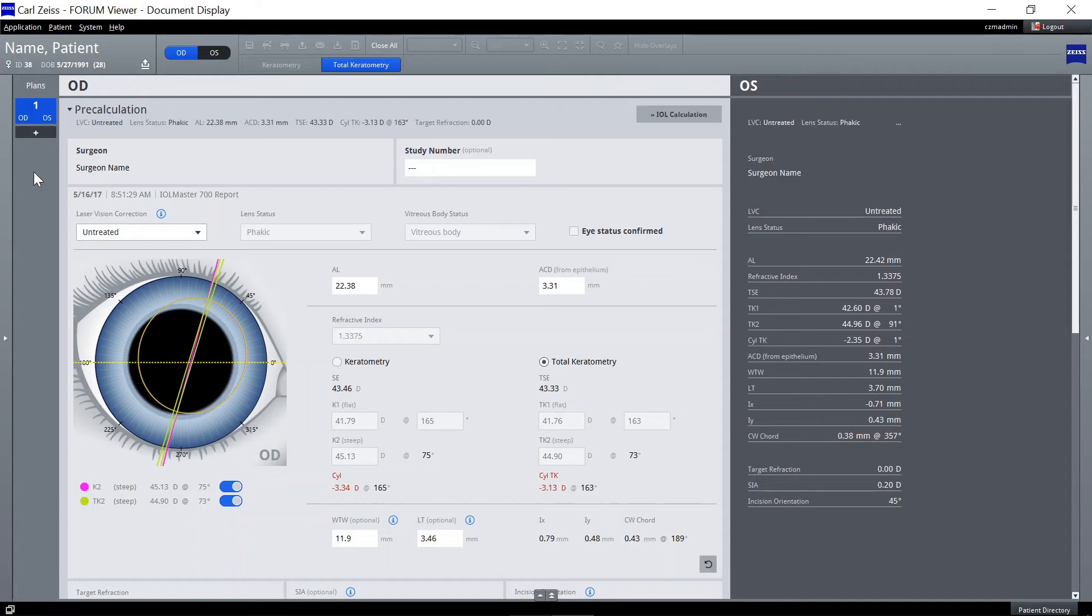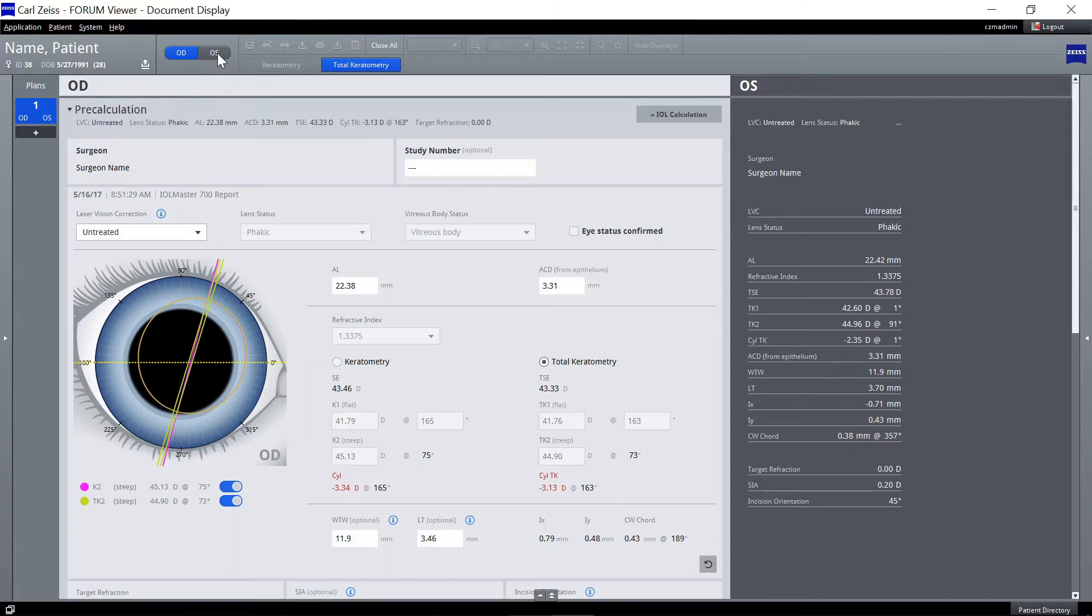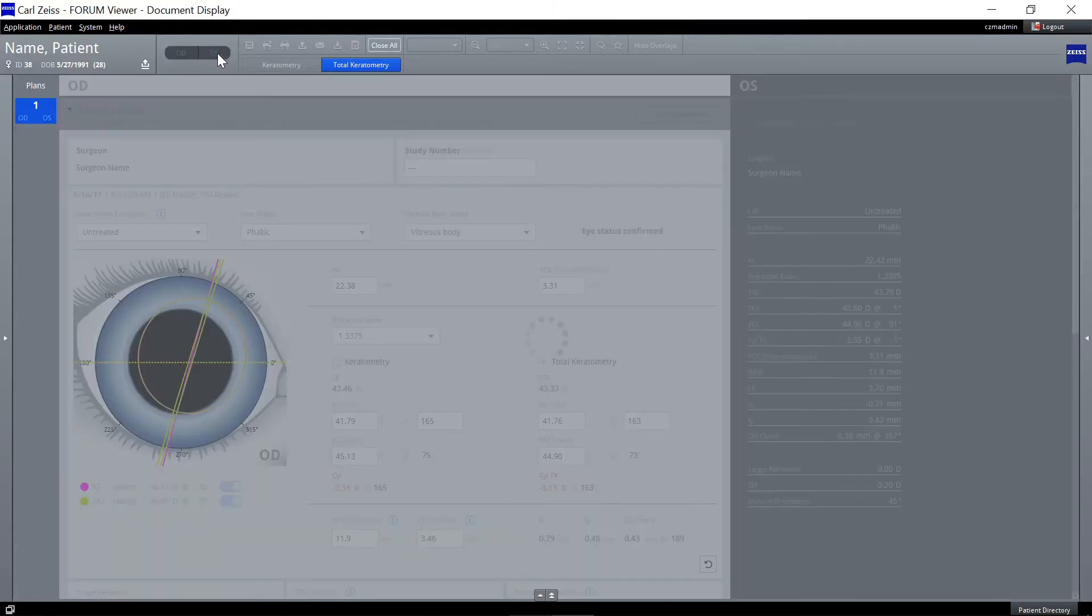When starting Zeiss EQ Workplace, OD is selected by default. Change the laterality by clicking on the switch button in the header toolbar.